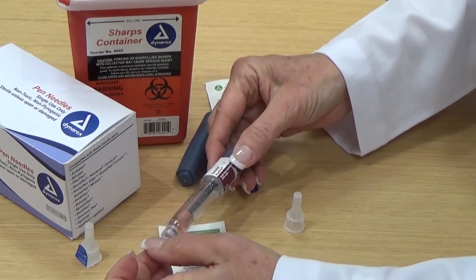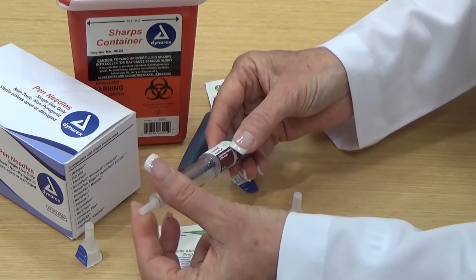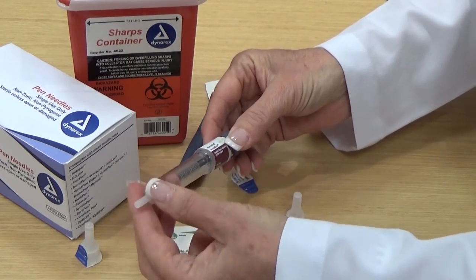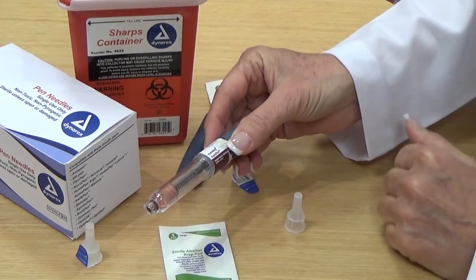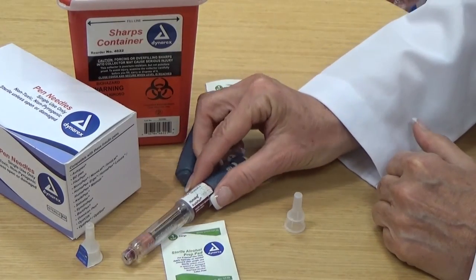And then when you're finished you'll put the cap back on, twist and turn and remove it, and put it in the Dynarex sharps container. For many more Dynarex products, please visit Dynarex.com.